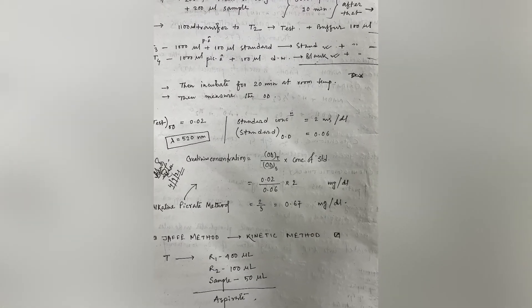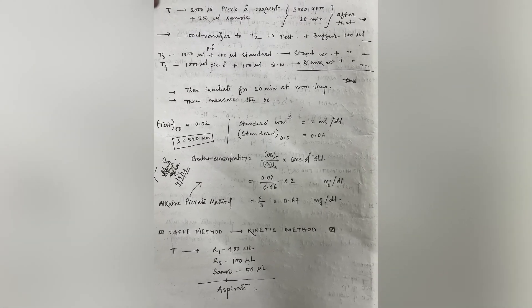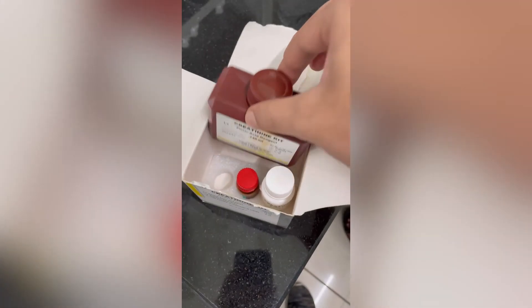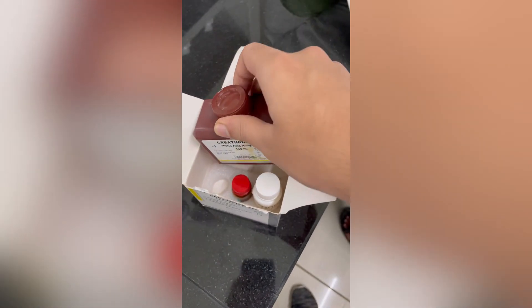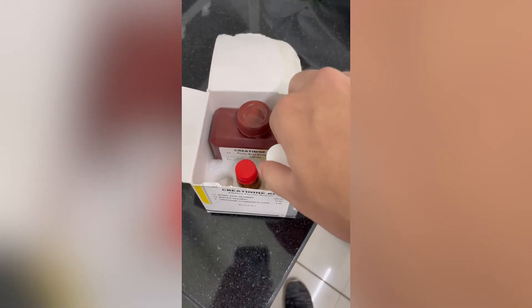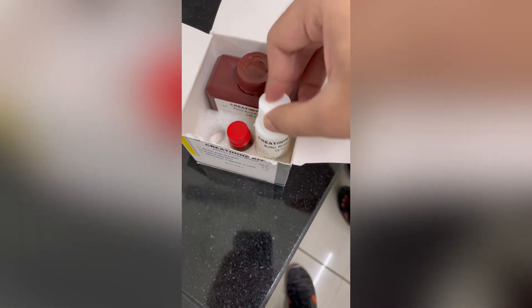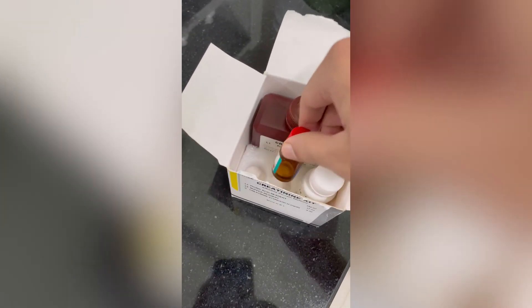Creatinine estimation using the endpoint method. This page shows the whole procedure and a sample calculation of the experiment done in class. Take a screenshot of this. The requirements are picric acid, which is the creatinine kit, the buffer reagent, and the standard.